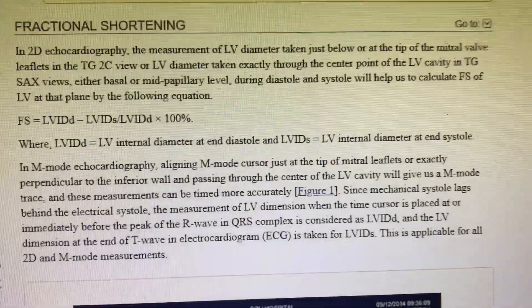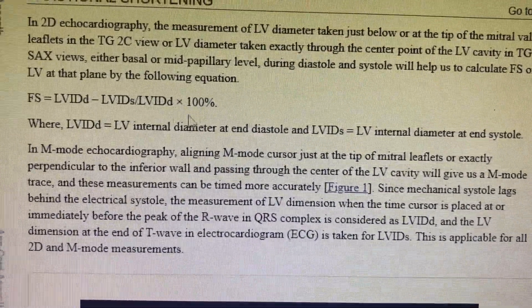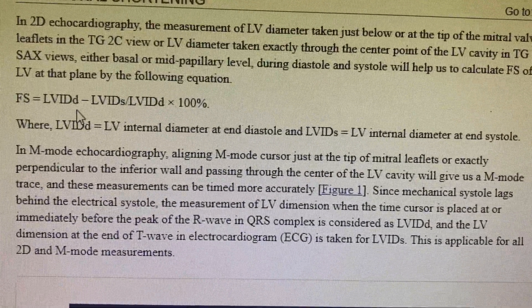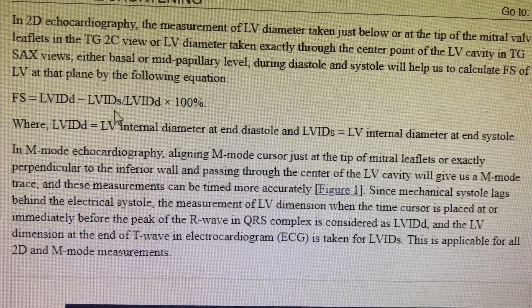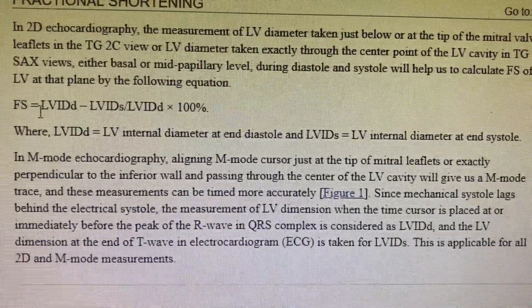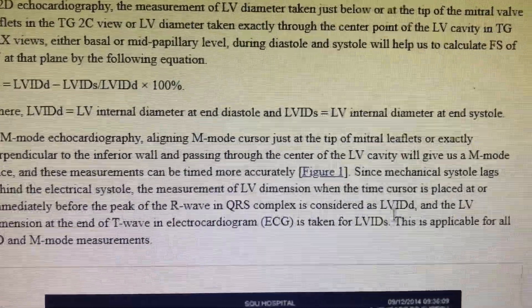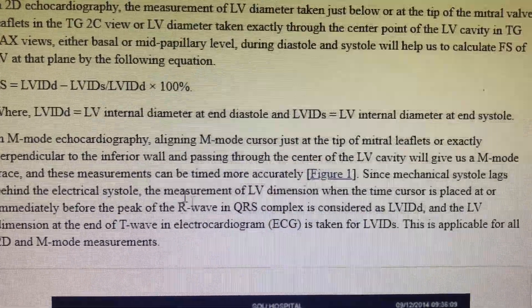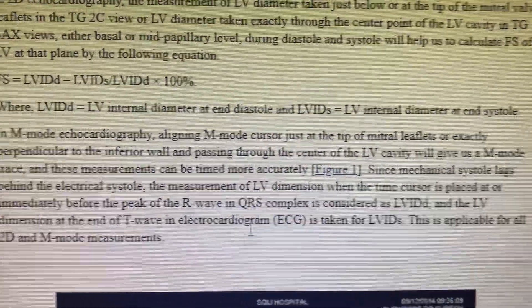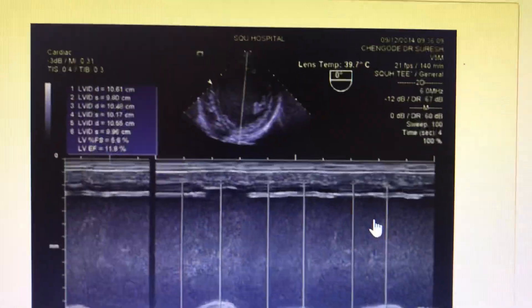This is what fractional shortening is — a simple tool used many times in day-to-day practice. LV end-diastolic diameter minus LV end-systolic diameter, divided by LV end-diastolic diameter, gives you the fractional shortening. End-diastole is taken just before the peak of the R wave, and end-systole is considered at the end of the T wave.